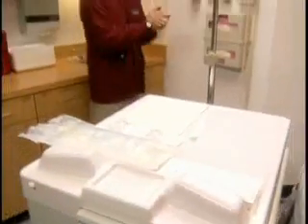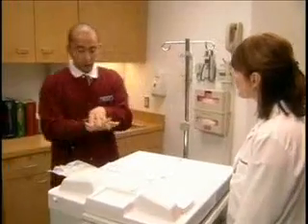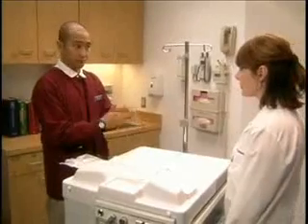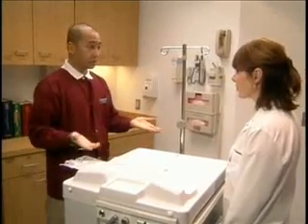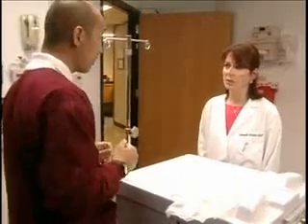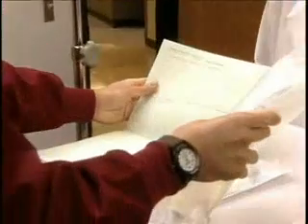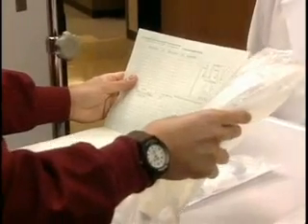Okay. Looks like you have all the supplies you need. So what's the situation with your patient? Well, she was admitted to the hospital with a generalized infection due to a urinary tract infection. She'd been receiving IV fluids to help with dehydration because she's been experiencing loss of appetite and fever. Okay. So what are the orders? Let me see here. Half normal saline solution to be infused at 125 cc's an hour. Okay. Well, let's check the solution and label it.